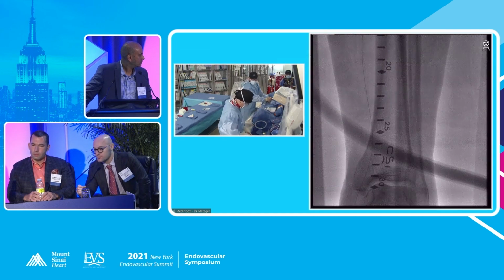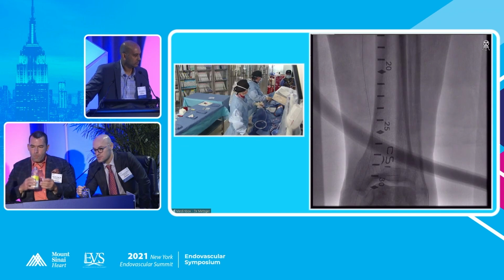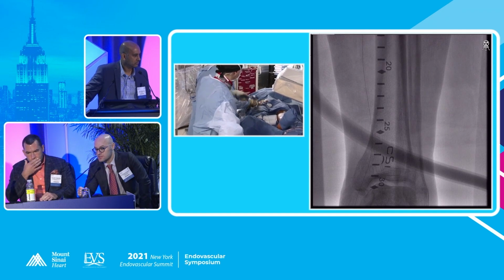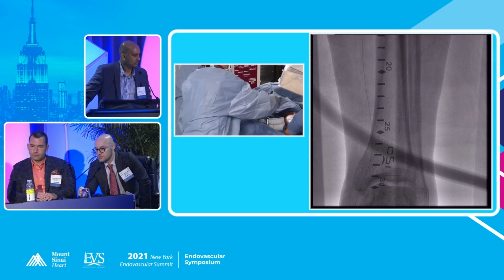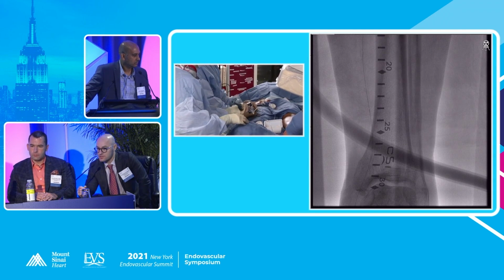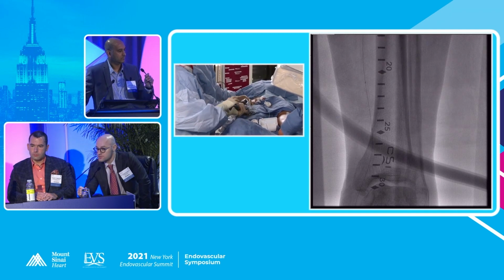Dr. Caroccio, I can't hear you for the first part. A bias being surgical, I think common femoral endarterectomy definitely can be done under local, but I would also treat the tibial vessel at the same time with an antegrade approach through that patch and spin it with orbital atherectomy. I think you need to get this guy or this woman flow all the way down to the foot.